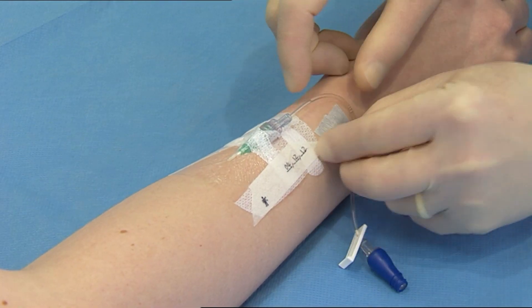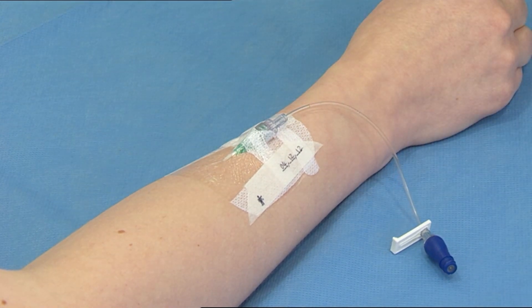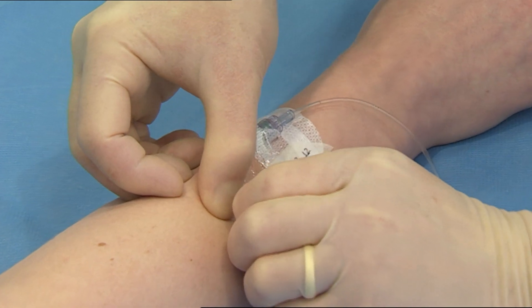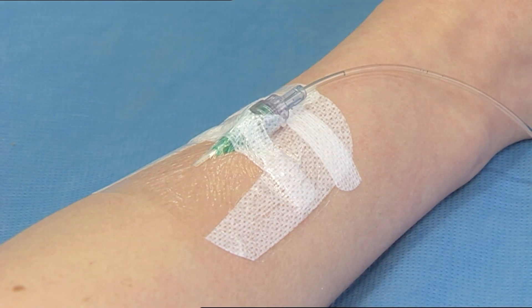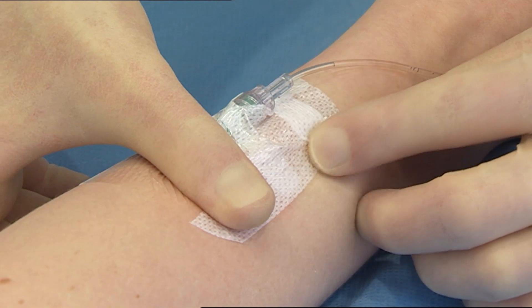Remove any additional tapes that have been used to secure the extension set. Remove the date record label from the dressing. Carefully remove the first of the securing strips.